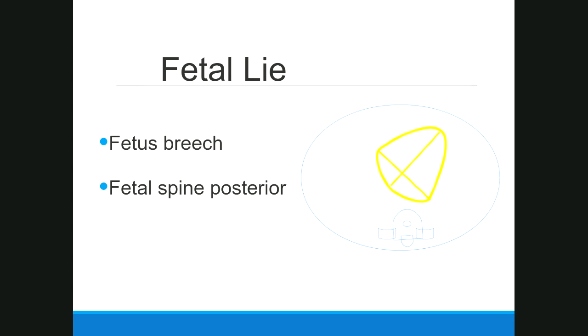This is a perfect example of if you're not comfortable with that and you're like, oh, okay, well, the last patient that I scanned had a posterior spine, but the heart was pointing the other way, so therefore this has to be abnormal. Not necessarily. The last one was a cephalic presentation. This is a breech presentation. So if you think about flipping the fetus around in utero, it's totally normal for the heart to be pointed this direction due to that fetal presentation.